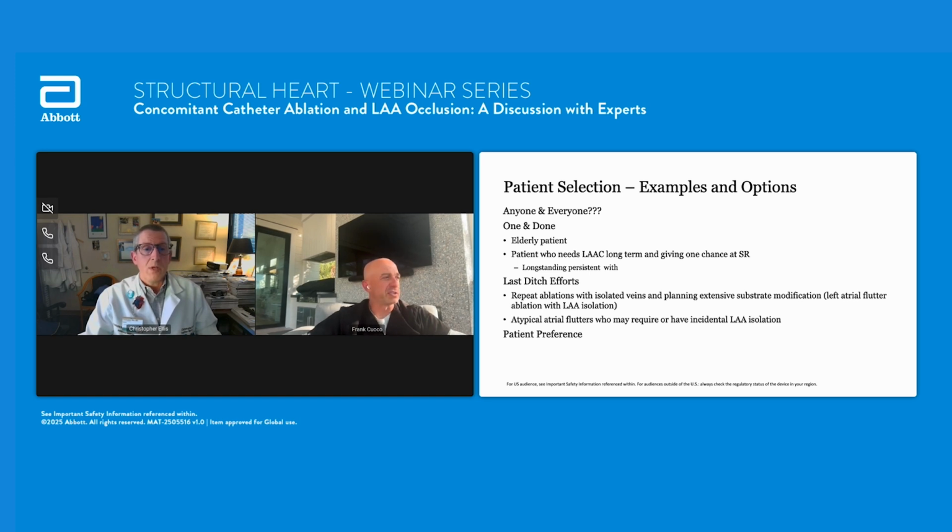Yeah, I agree. I think these CHA2DS2-VASc scores, certainly the 1s or 2s, that I think we're trying to figure out, do they really need anticoagulation after the ablation long term? But I agree, the higher risk scores, the 4s, the 5s, those are people that I'm not going to feel comfortable telling them, especially if they were persistent AF in the past, hey, we're good to just take you off anticoagulation 3 months after the ablation. I think as the data comes out, those will be people that probably will go straight to ablation and left atrial appendage closure.